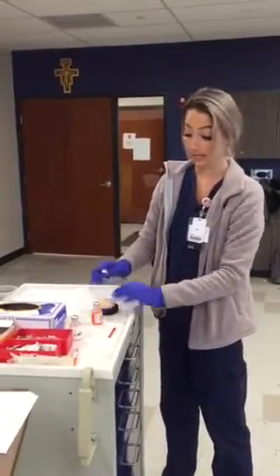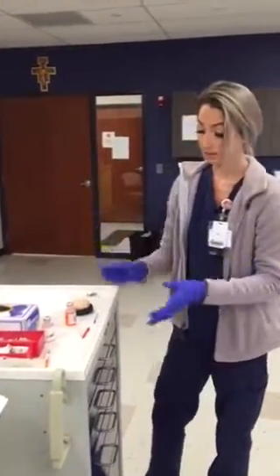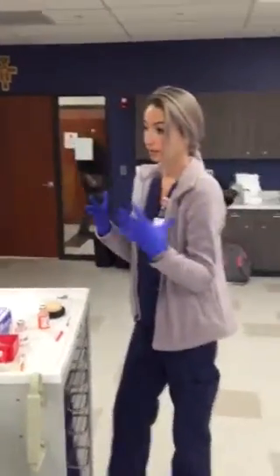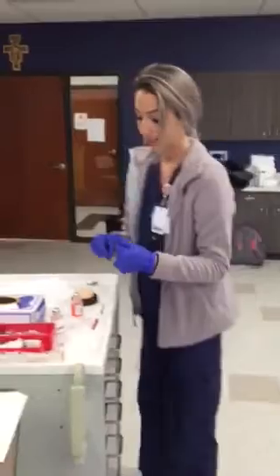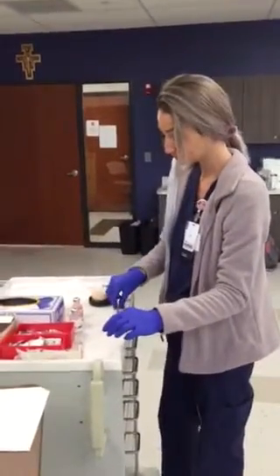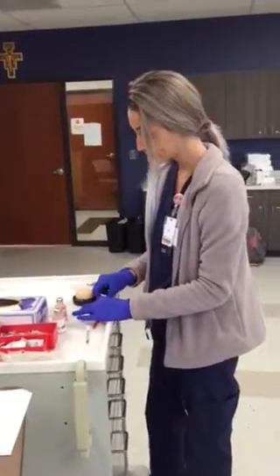Again, I'm wiping everything. I'm disposing of both the needles. I wiped them with the alcohol swab before and after, wiped her arm. If she's bleeding, I would give her a Band-Aid. So this was her vitamin B12. Now for her heparin, she's getting 1,500 units.